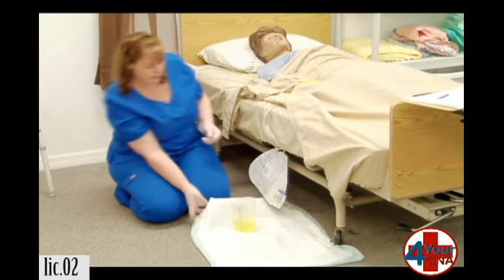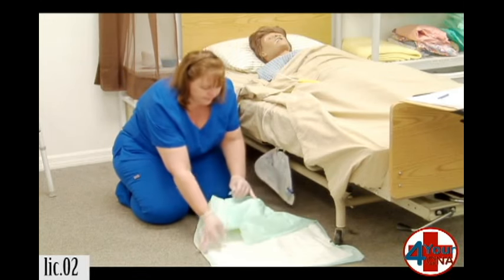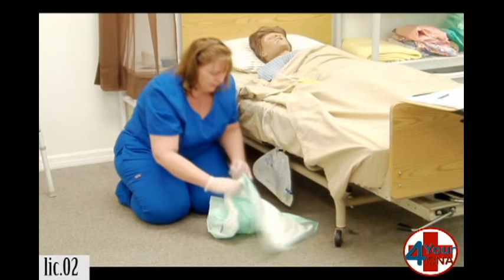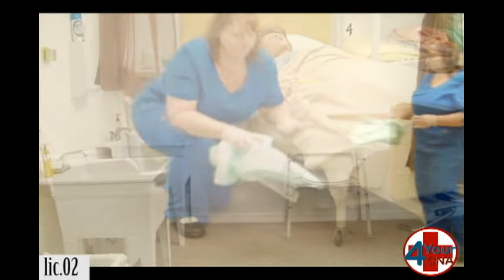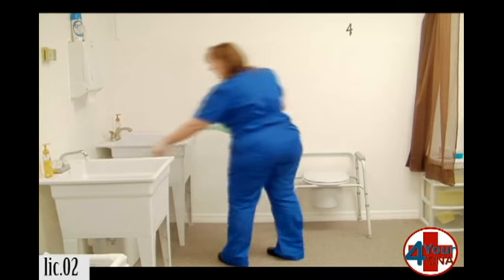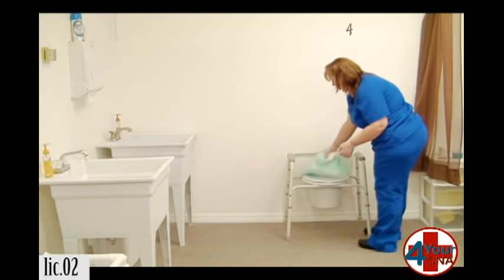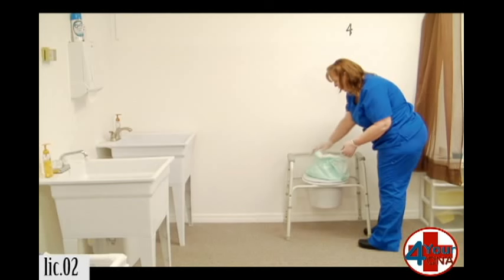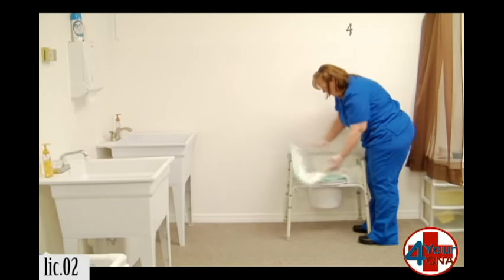Now I'm going to take this over to the toilet to measure it, dump it, and clean it. Ms. Jones, are you doing okay? I'll be right back to get you situated. I'm going to throw the alcohol pad away and set the urine container down onto the toilet, making sure it's on the barrier — that way if there's any urine on the container, it doesn't touch the toilet.